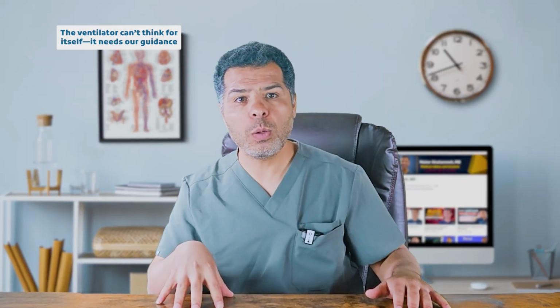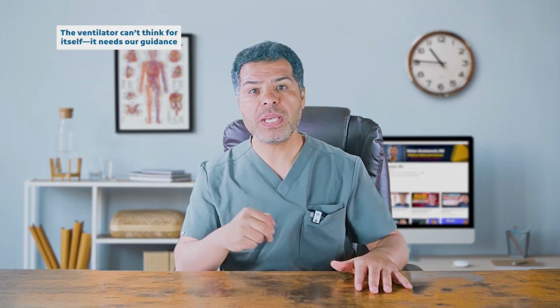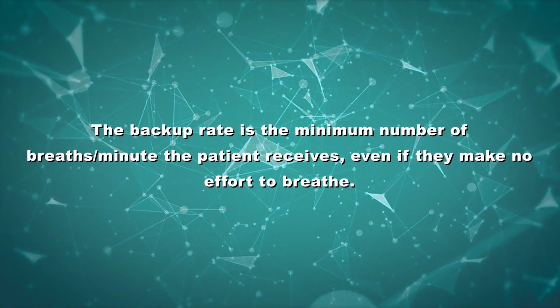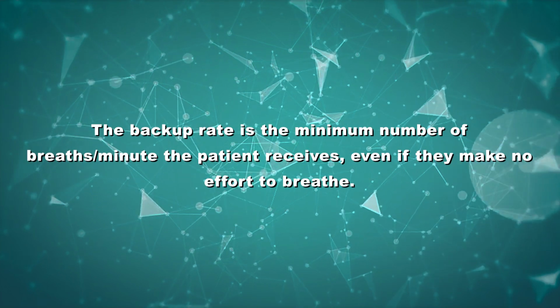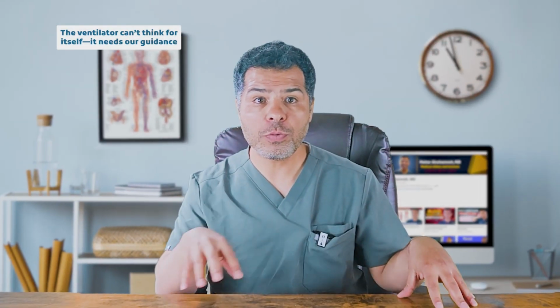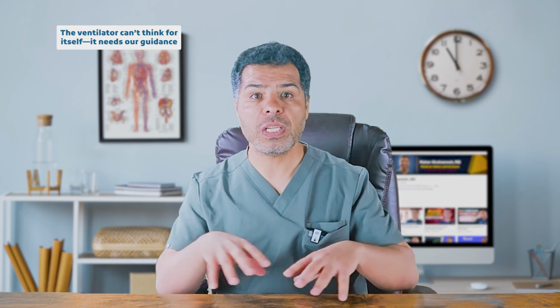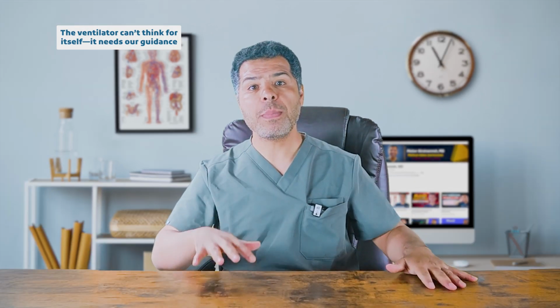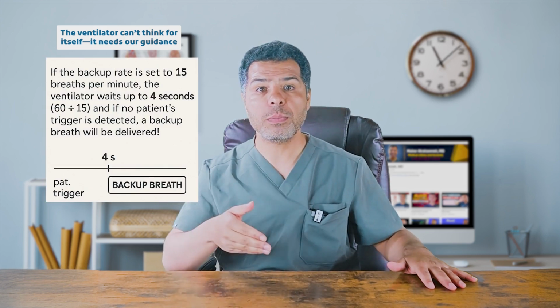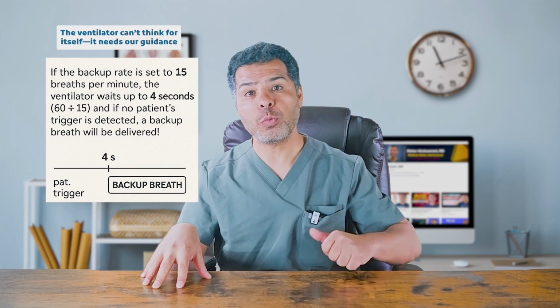But what decides how long the ventilator should wait before delivering a backup breath? This timing is based on the set respiratory rate, also known as the backup rate. This is the minimum number of breaths per minute the patient receives, even if they make no effort to breathe. The ventilator will listen to the patient for a period equal to 60 seconds divided by the backup respiratory rate before delivering the backup breath. For example, if the backup rate is 15 breaths per minute, the ventilator waits up to 4 seconds, 60 divided by 15, and if no patient trigger is detected within 4 seconds, a backup breath will be delivered.